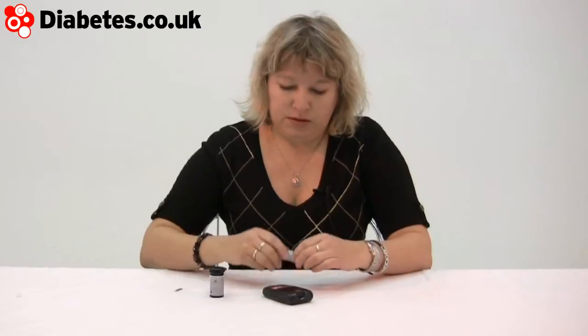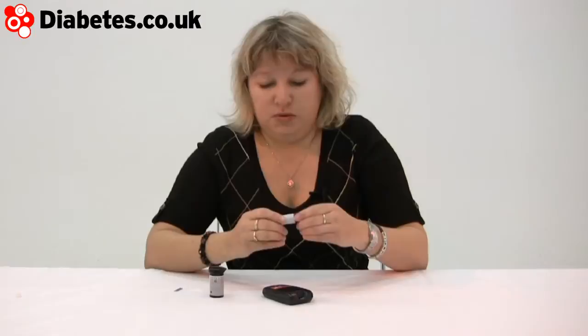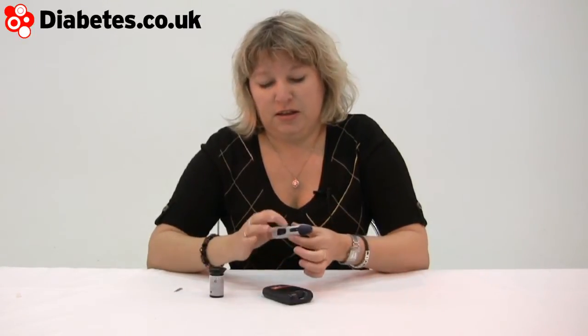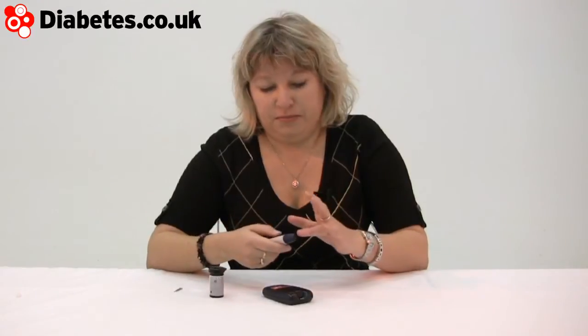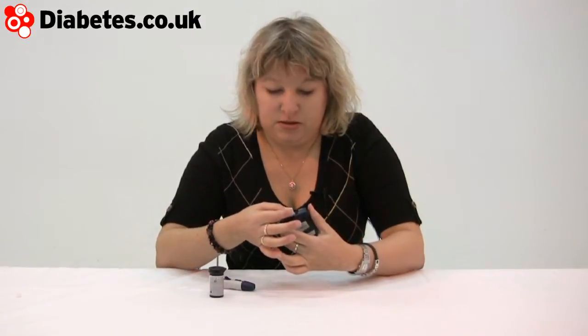Simple enough button to turn it on. It's a simple enough blood test machine. You've got your lancet — you can twist it round for the depth setting, charge it like that, and then release it with that button.